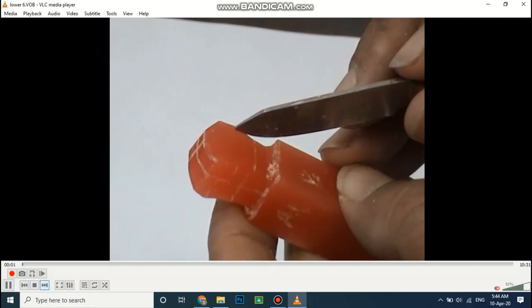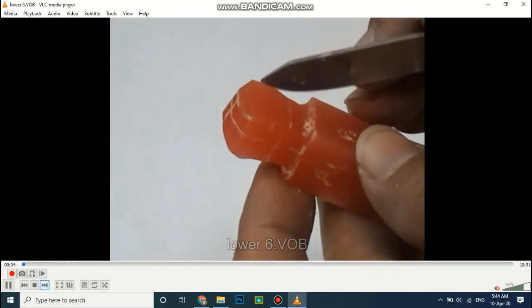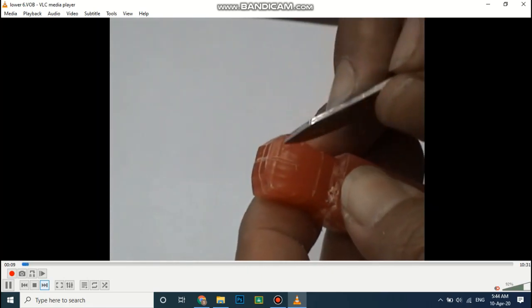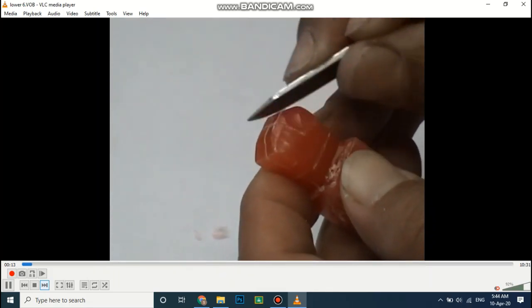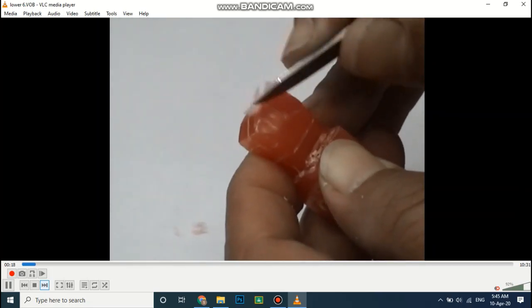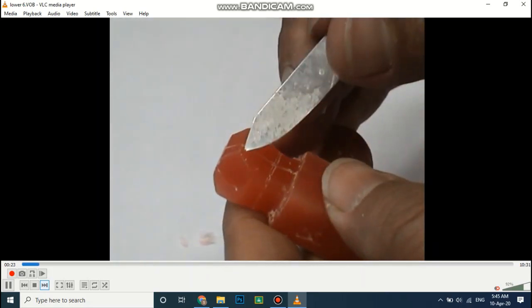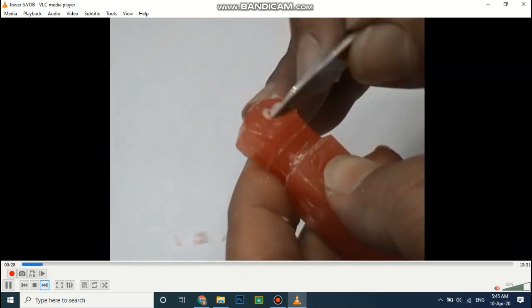The third step is to create the distal convergence. Distal convergence is done by drawing a midline gently above the cervical ridge buccally, reducing the wax towards the distal surface above the cervical ridge, of course, just by 1 mm reduction. By this step we reduce the distal surface.